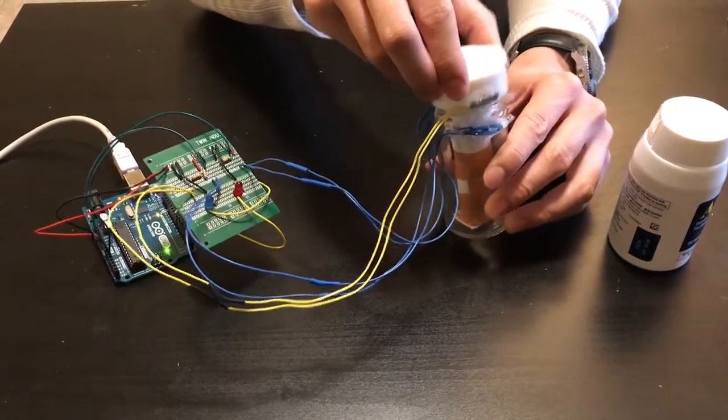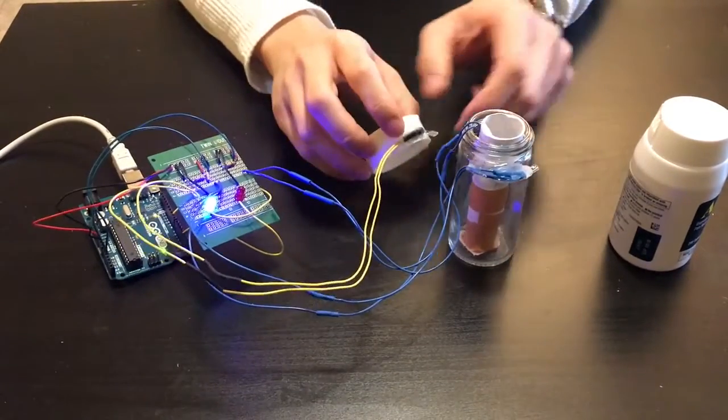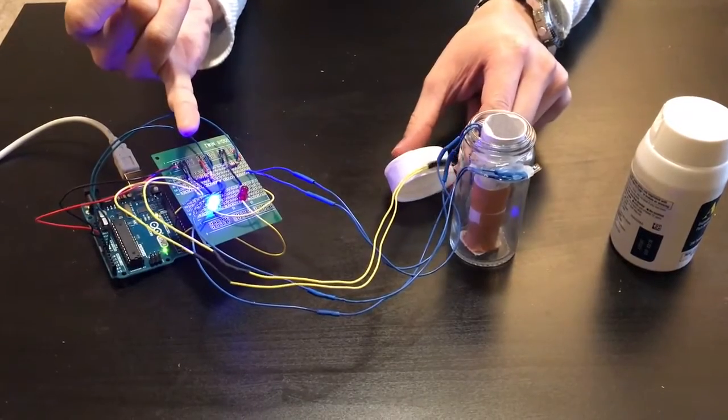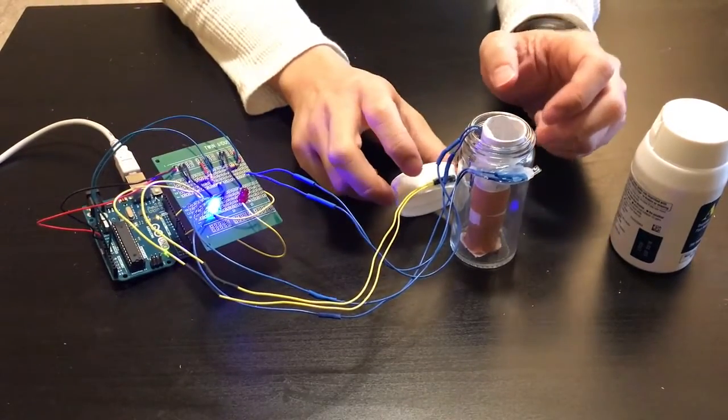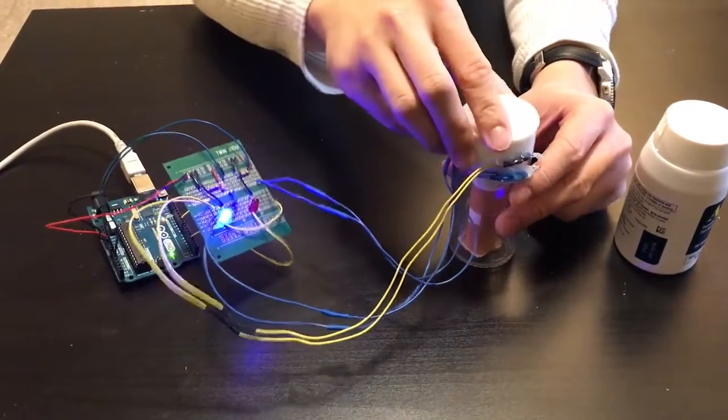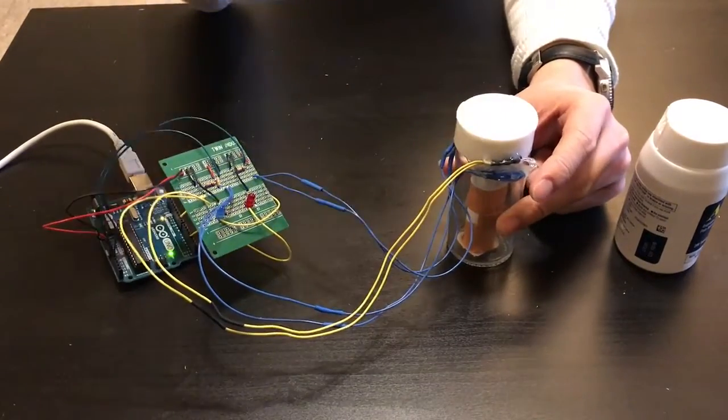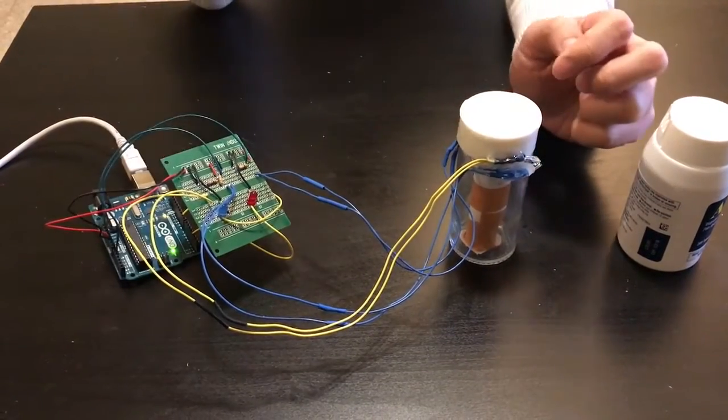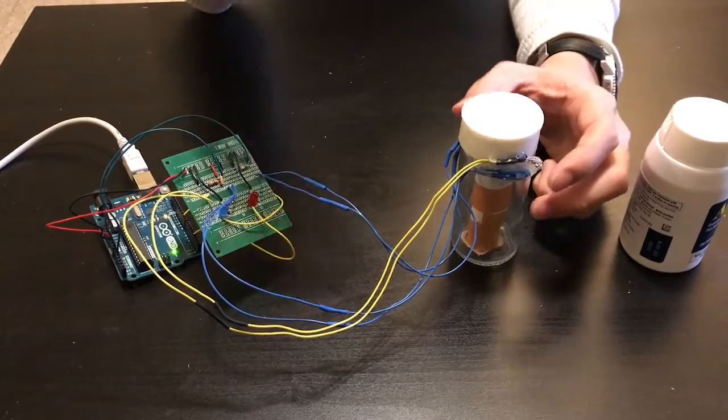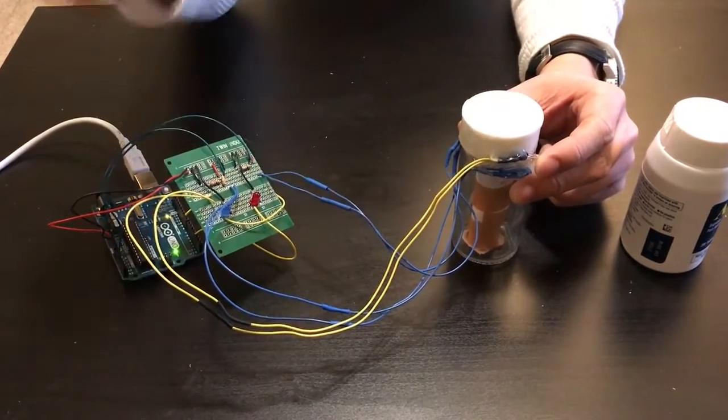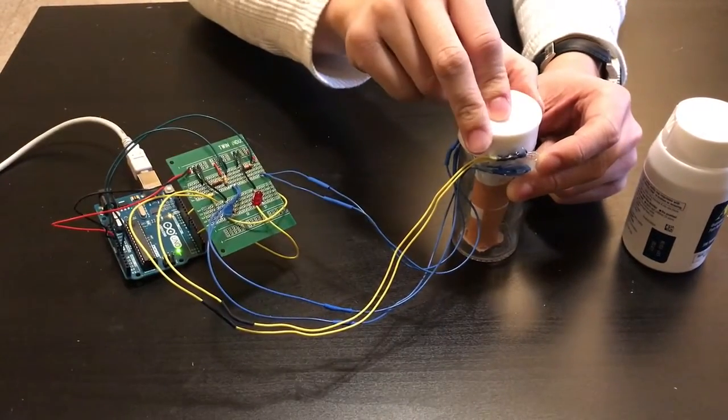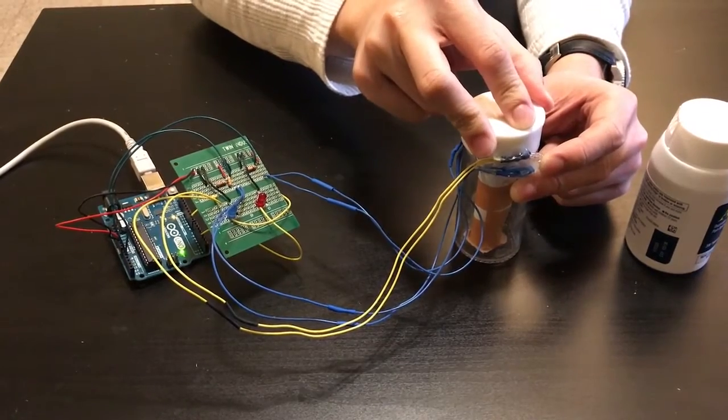As you can see when the pill bottle is opened this blue LED indicates that the pill bottle has been opened and if we close it that it will turn off. This on and off signals the opening and closing of the pill bottle. This information will be sent to our app and it would be able to detect if the patient has taken the pill.